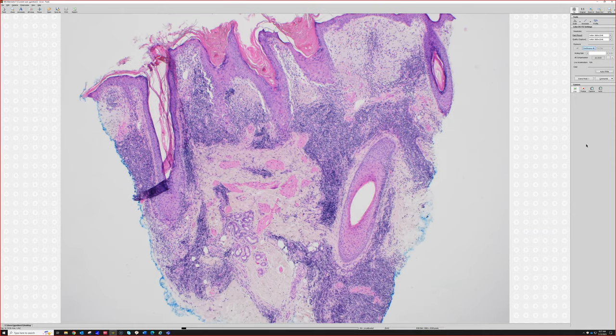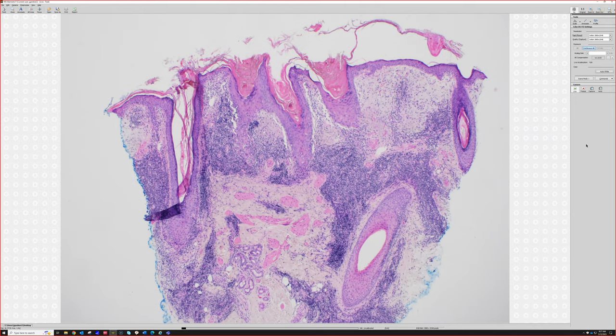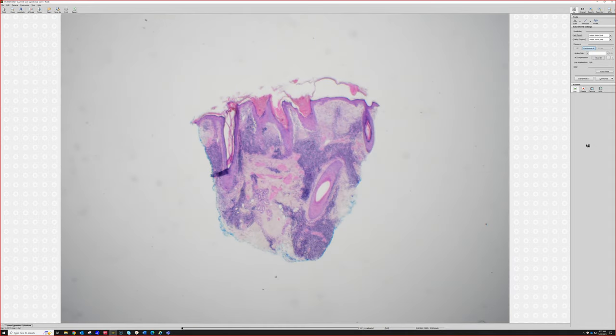And what we've got, what's that? The keratin plugging also, I feel like, is very helpful. I don't know if that's significant. You know, yes, very good. Yes, that's right. So this is discoid lupus erythematosus.